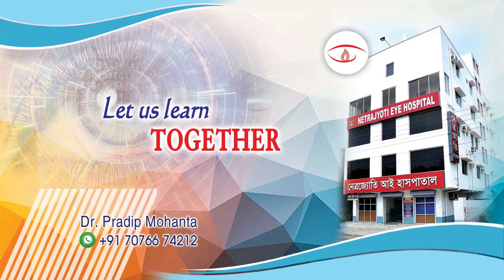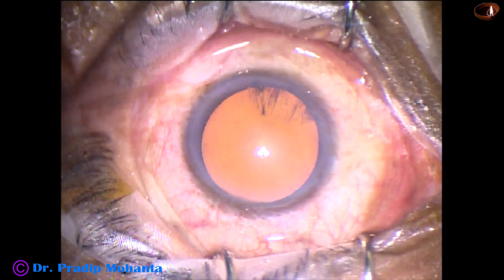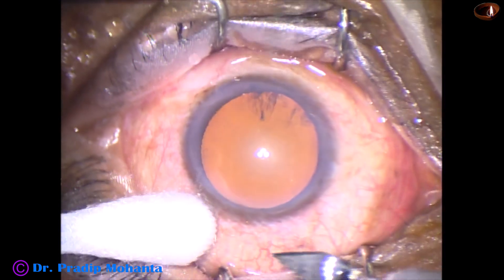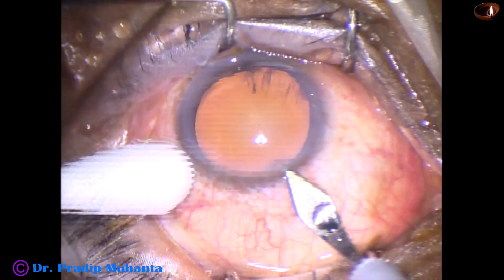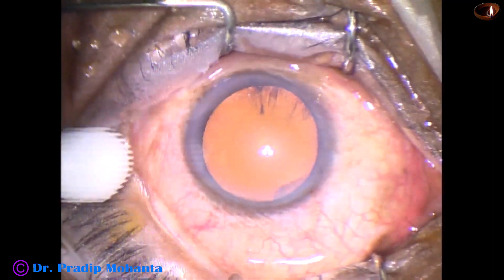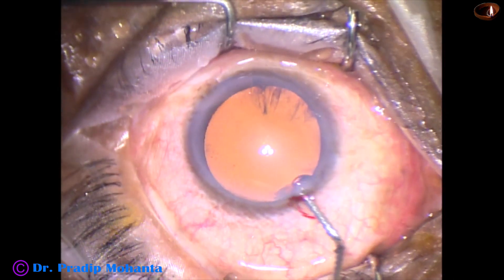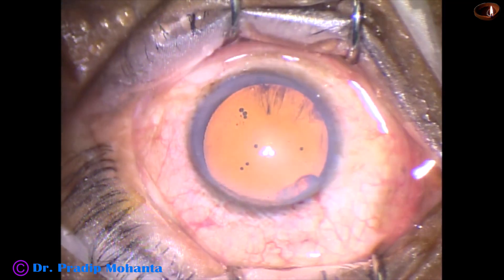Friends, welcome to my workplace at Ranaghat, West Bengal, India. This is a cataract with grade 3 nuclear sclerosis. The microscope being used is Leica 690, and to this microscope, Omni Glow has been attached — that's why we are getting a beautiful red glow. The FACO machine being used is Oertli Catarax Easy from Switzerland.